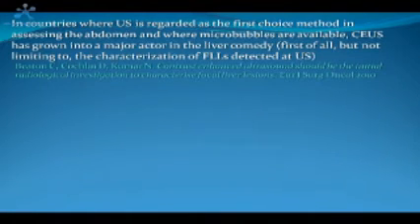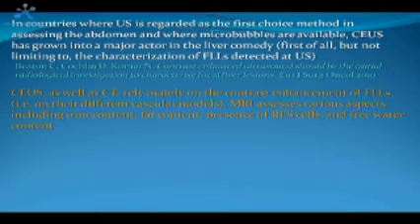So, some conclusions. I believe that at least in countries where ultrasound is regarded as the first imaging modality to study the liver and the abdomen, and in countries where microbubbles are available, of course, CEUS has grown into a major tool to assess the focal liver lesion. Mostly those detected at ultrasound, but not limited to these. So I fully agree with the title of this recent paper.